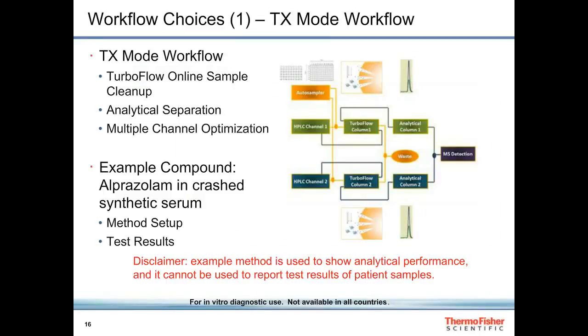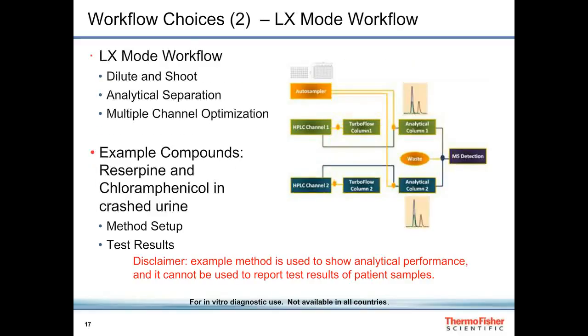The Prelude MD HPLC allows you to choose between TX mode, which utilizes TurboFlow sample cleanup prior to the final separation. The autosampler injects the sample into the loading pump's flow to the TurboFlow column. In LX mode, the autosampler injects the sample directly into the eluting pump's flow of the HPLC column.